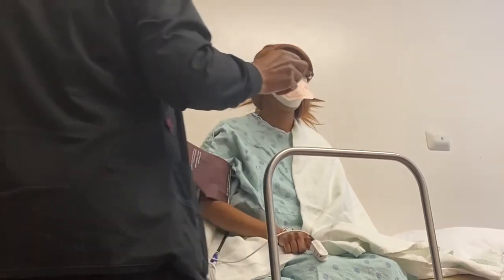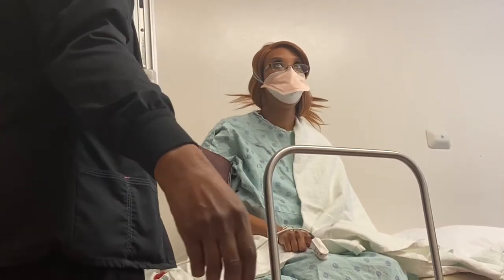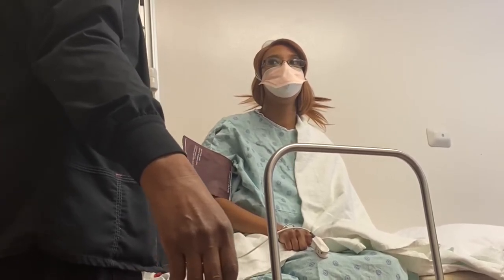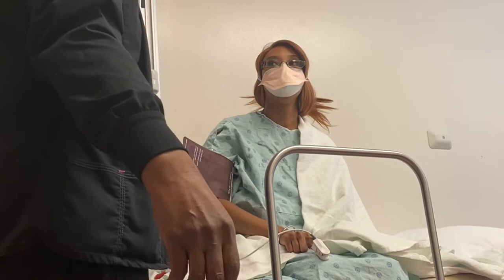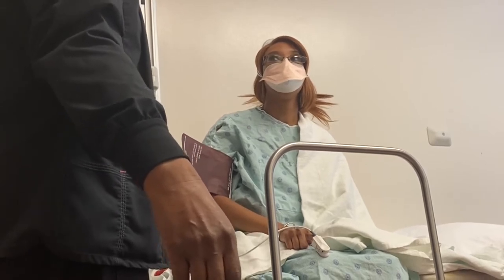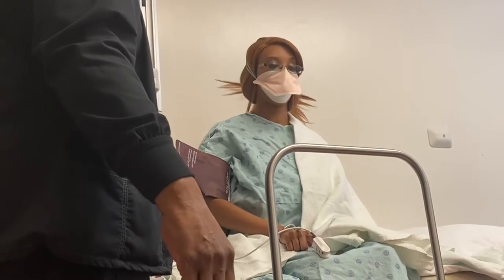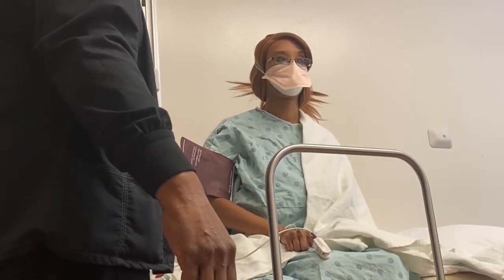Hopefully it'll be fine because I went to the ENT and they put one down my nose. Okay. But it wasn't as long as that. That's right. So they just go right here to look at the vocal cords. Yeah. But we go down to the stomach. You probably have a little gag. That's why we want the stomach empty.